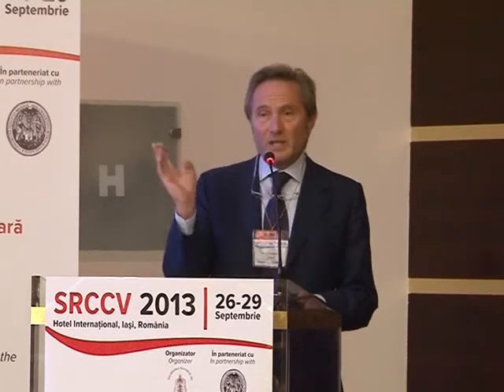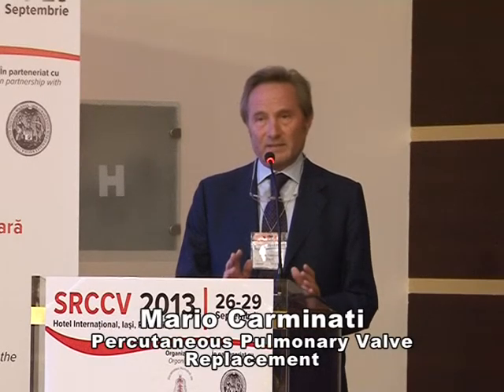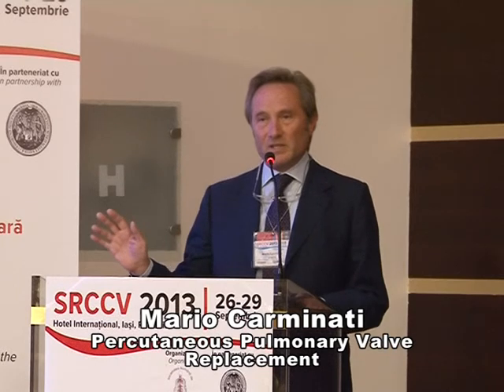Well, it's a limitation indeed, because if we have an RV outflow tract which is too much dilated, too large to put a stent in, we have to deal with other devices, larger ones. I mentioned to you the pioneer experience of the self-expandable stent. That is probably the way to go. So the transannular patch itself is not a limitation. Well, it is a limitation so far, because we don't have devices that are suitable for all kinds of anatomy.